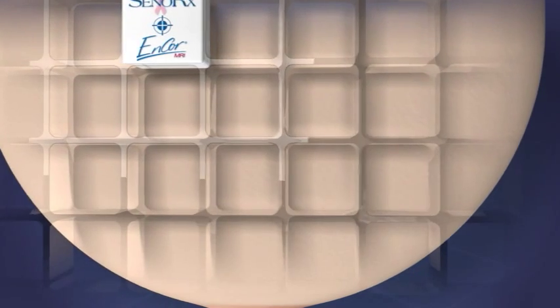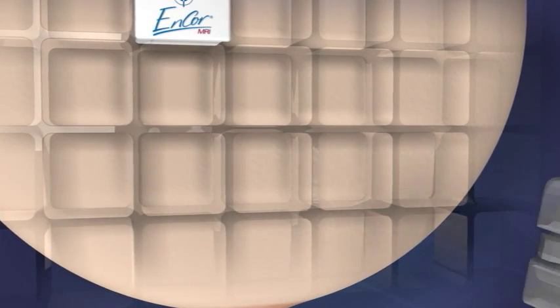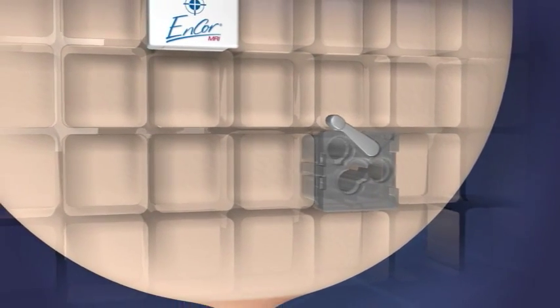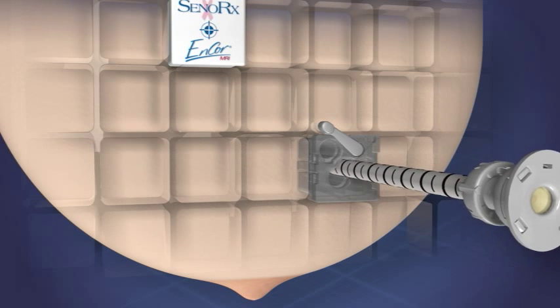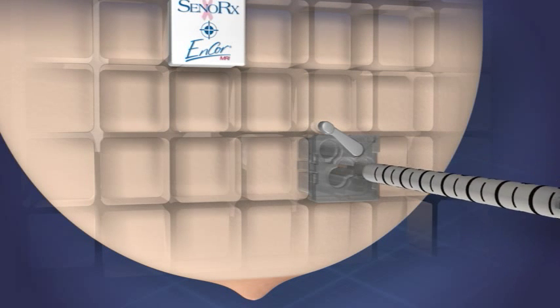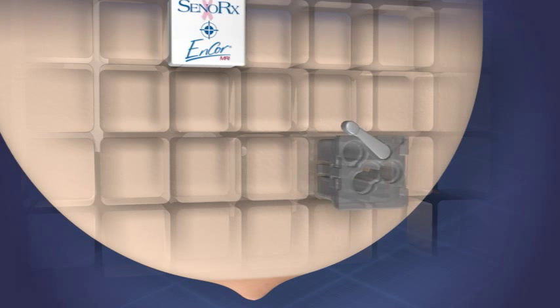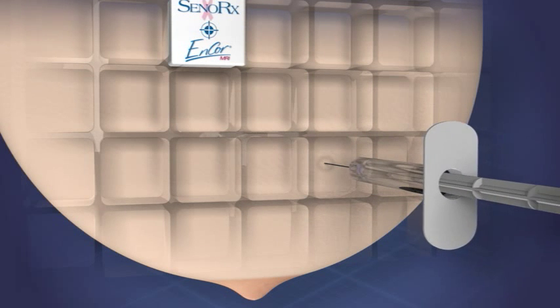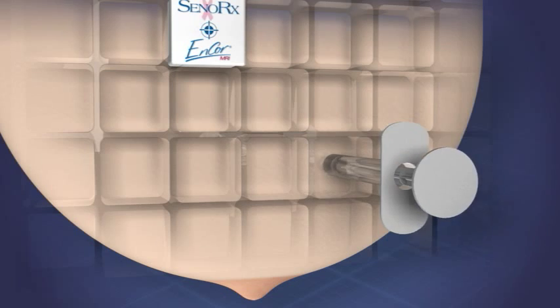Once the lesion position is determined, the locking block is loosely inserted into the fenestration. A skin mark on the surface of the breast is then created within the selected area of the block. Remove the block and administer the preferred anesthetic, both superficially and deep in the region of interest.